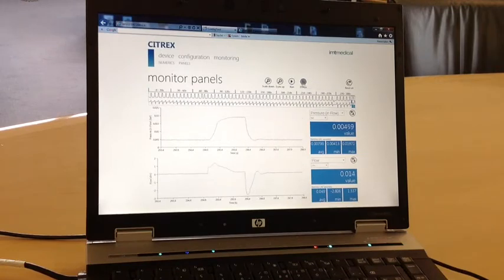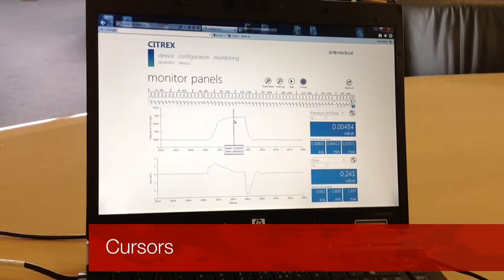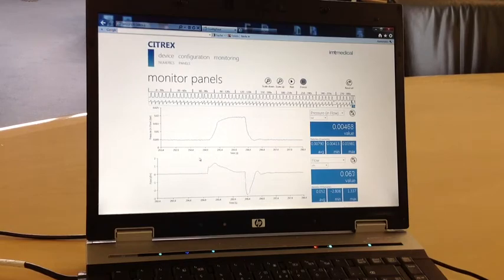Zoom in and out of your charts and analyze them with cursors. Additional statistic data like average, minimum, and maximum values are also available.